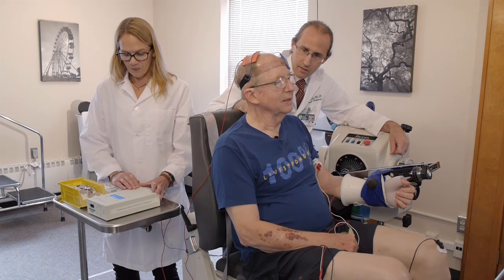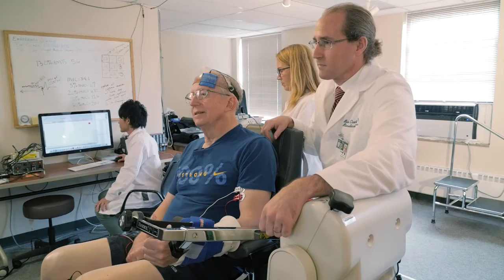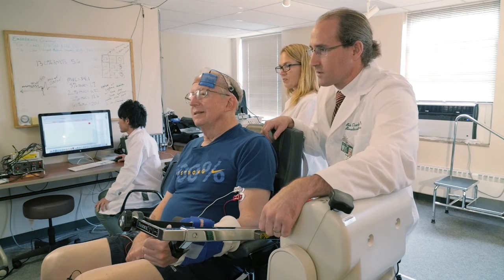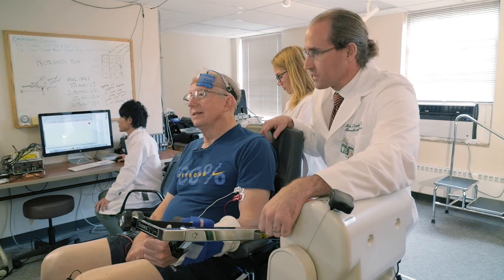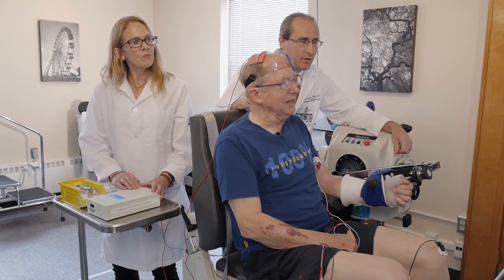We're going to rest about a minute and do that two more times. Okay, Rob, here we go — pull up again as hard as you can. Pull, pull, pull, pull, pull, pull, pull. And relax.